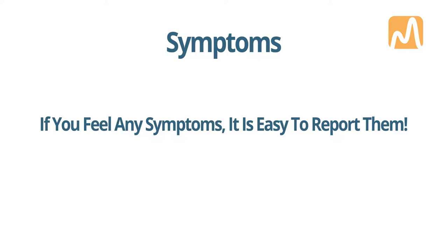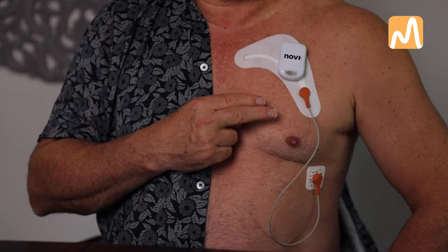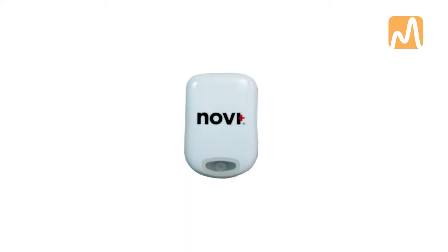Symptoms. If you feel any symptoms while wearing the device, it is very simple to report them. Symptoms can be dizziness, palpitations, fluttering, fainting, chest discomfort, tightness, skipped beats, or what you describe to your physician. First, using your index and middle fingers of your right hand, quickly double tap the center of the device. You will see a blue light for about 2 seconds. This indicates that you have marked your symptom.